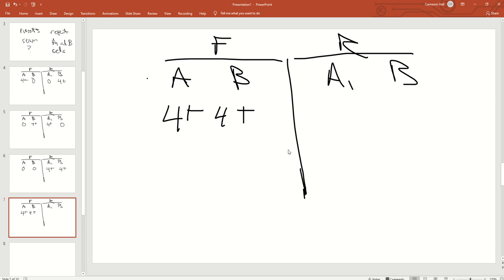What if we see these reactions? 4+, 4+. Well, now we're thinking they have A antigen and B antigen at the same time. What cell type has that? AB. So, would we expect them to have anti-A and anti-B in their serum? No. This is what we should see. 0, 0.